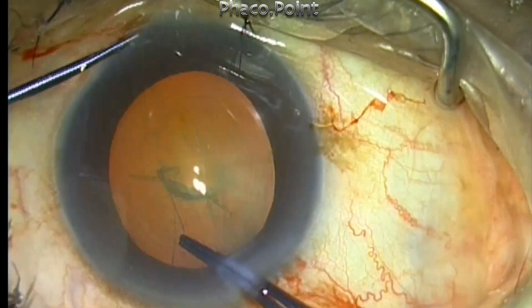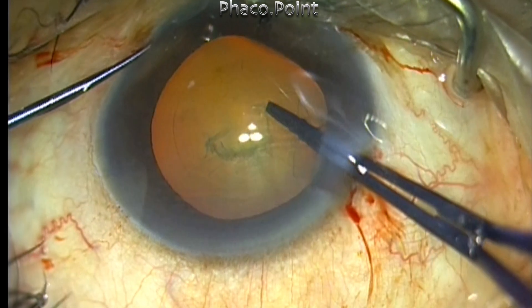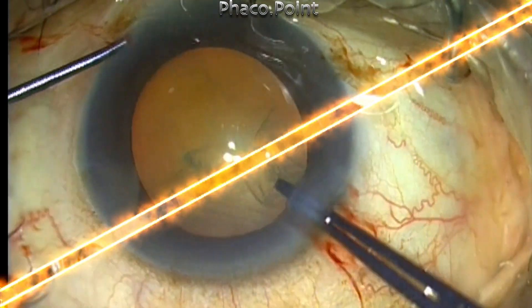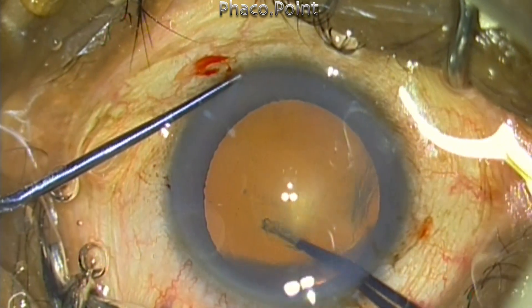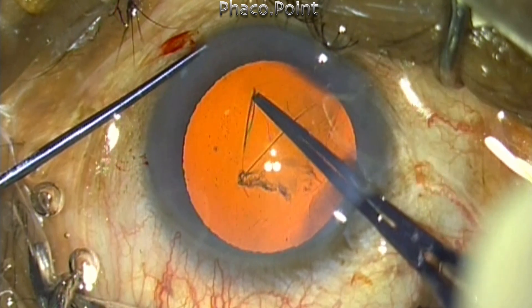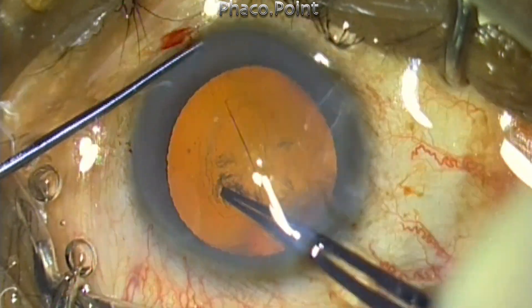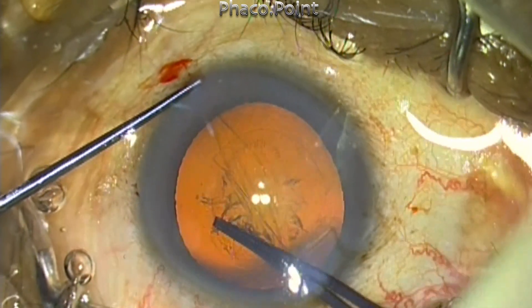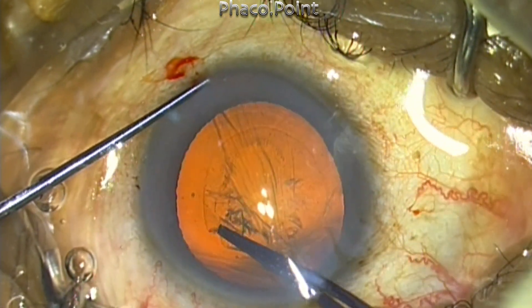The cystitome-like tear gives greater control while initiating the tear and taking it forwards for a few clock hours, while the forceps-like tear gives greater control in achieving good sizing and centration of the capsulorhexis. The forceps-like tear can be performed even if the anterior chamber is a little shallow, whereas the cystitome-like tear will cause the rhexis to run away in such situations, as the configuration of the lens is spindle-shaped.